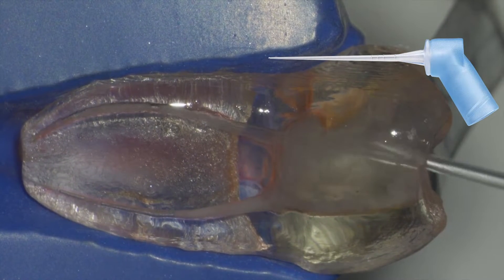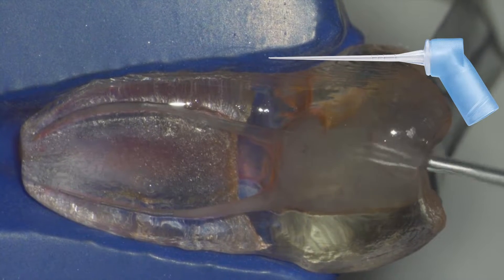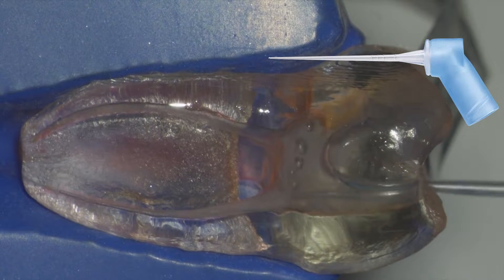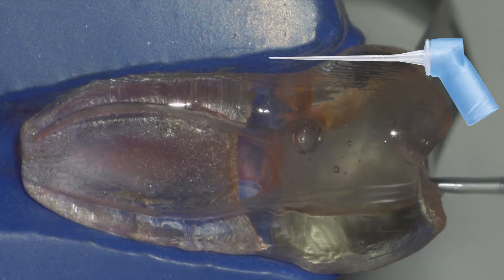The advantage to using a two-by-two and alcohol is it not only cleans away the debris but it also evaporates, so you can see the condition of your file — whether there's elongation of flutes or unwinding, as many of you call it.